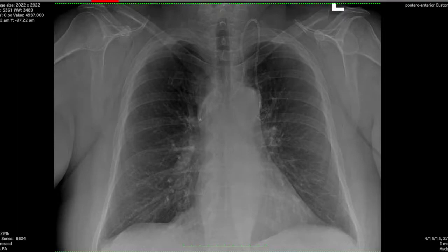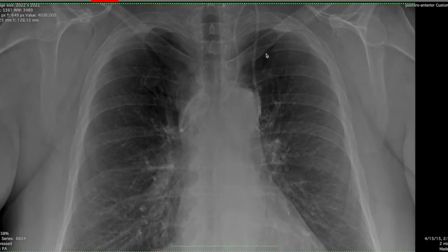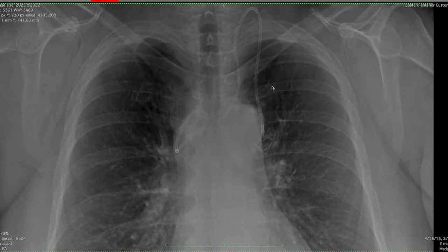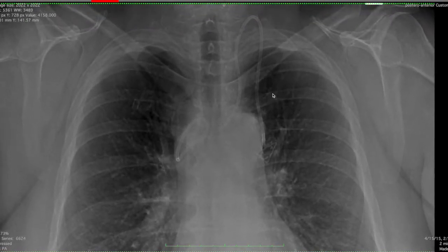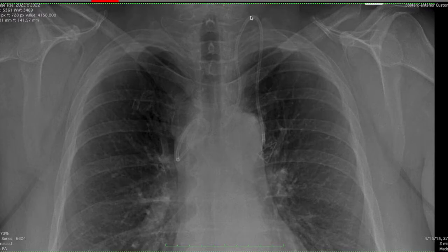So we have a nice bread and butter case here. This patient had a port catheter placement, not high up here in the neck, but it's an IJ line.